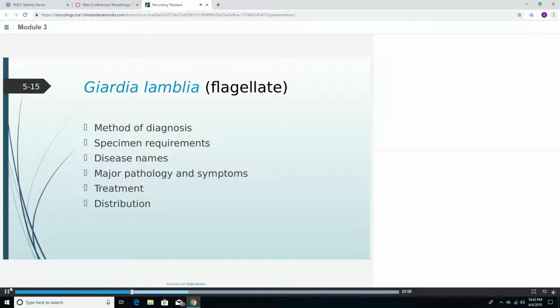A permanently stained smear for each specimen should be prepared and examined. We're going to want to examine areas of mucus in the feces for possible presence of parasites. And then there's also a string test. We could also do antigen-based immunoassays on fecal samples to see if we have a current infection. Fecal immunoassays provide a more sensitive detection of the parasite. Most often, though, doctors are just going to want to collect stool samples, because stool is where we could actually see the organism.